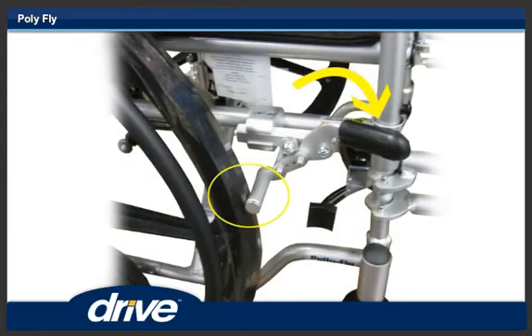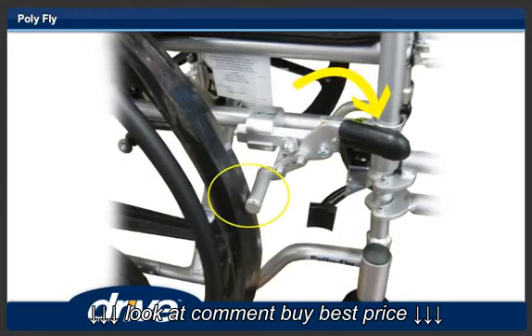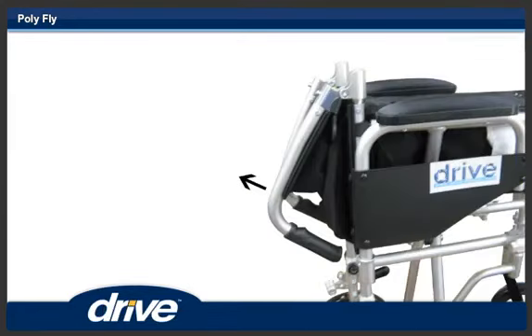Step 18. To engage the wheel lock on the 24-inch rear wheel, push the wheel lock forward to lock the wheel.